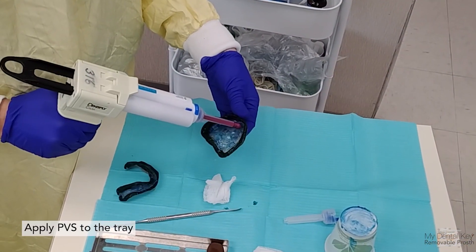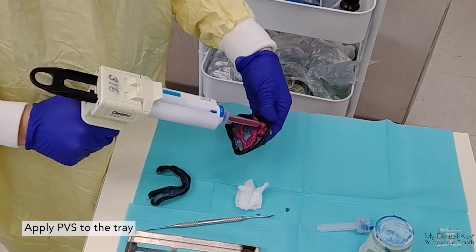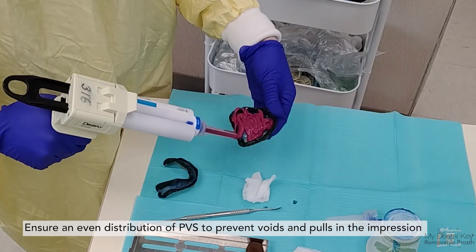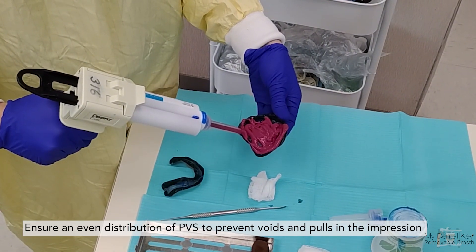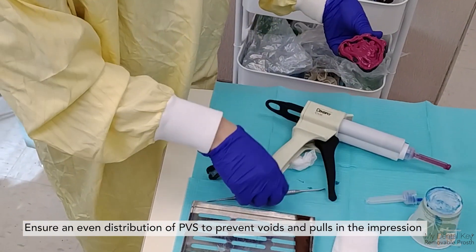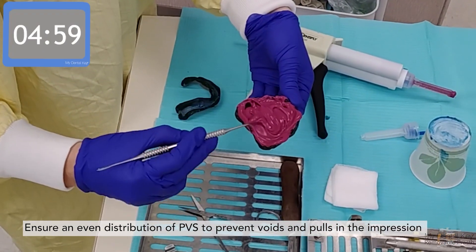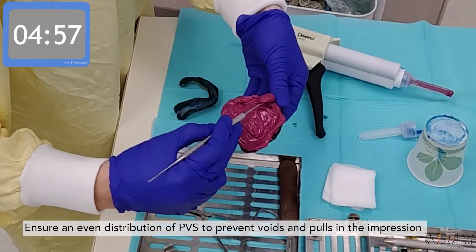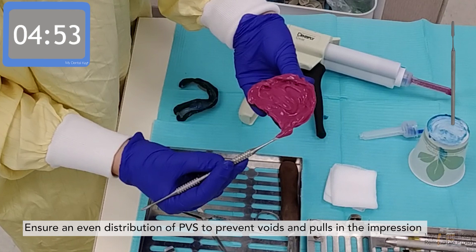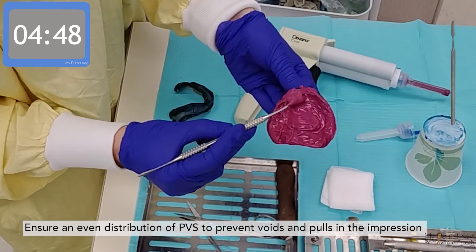Place the PVS into the tray by injecting the material from the impression gun. Butter the impression material into the tray as you apply it, evenly spreading approximately one to two millimeters of PVS throughout the intaglio of the tray. Start a timer for five minutes to keep track of the set. Use a hand instrument or spatula to continue evenly spreading the material to avoid voids and pulls in the impression.